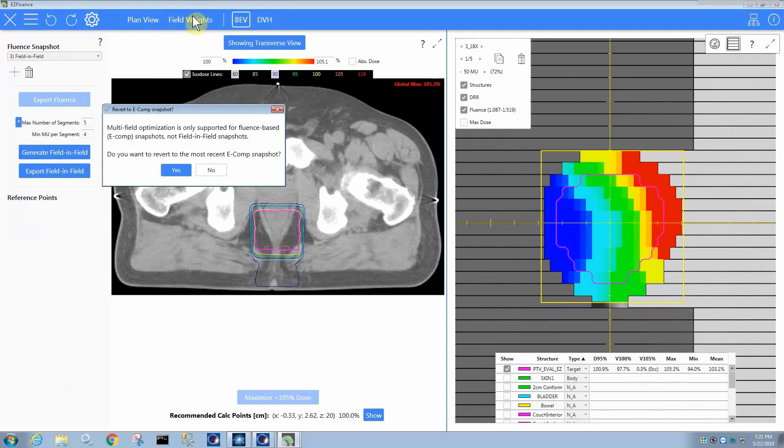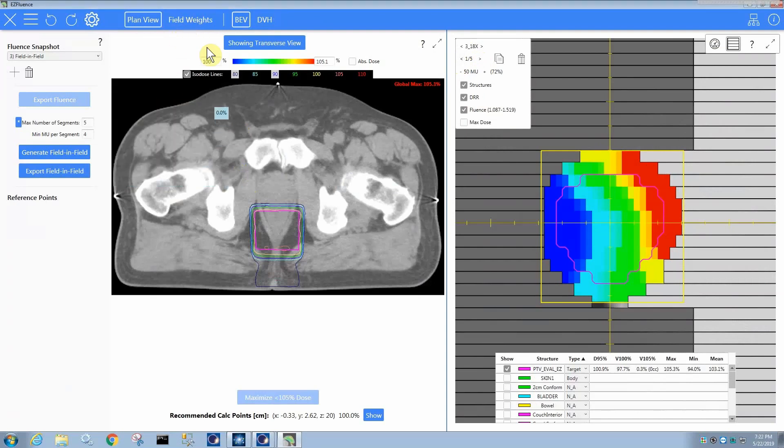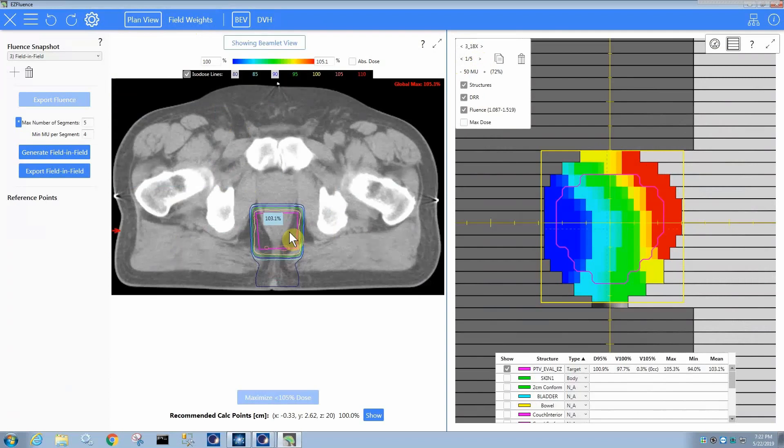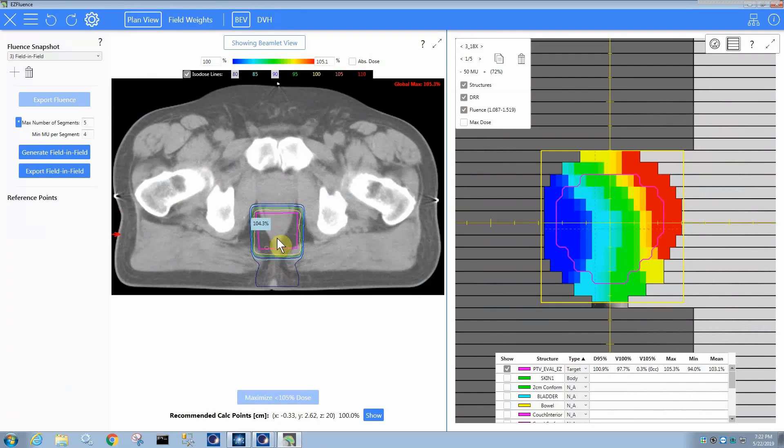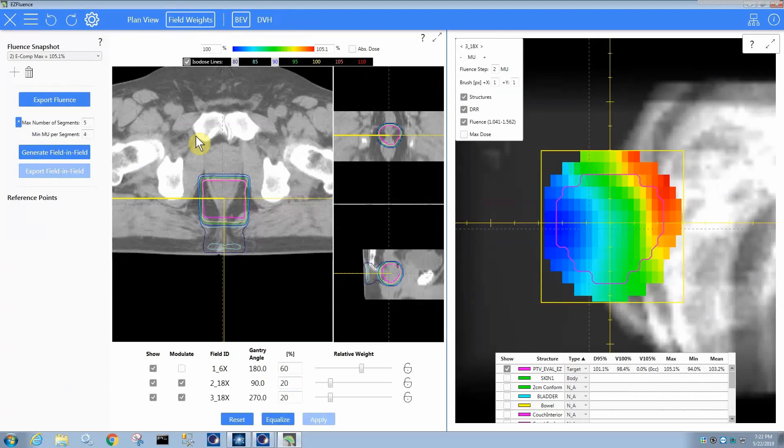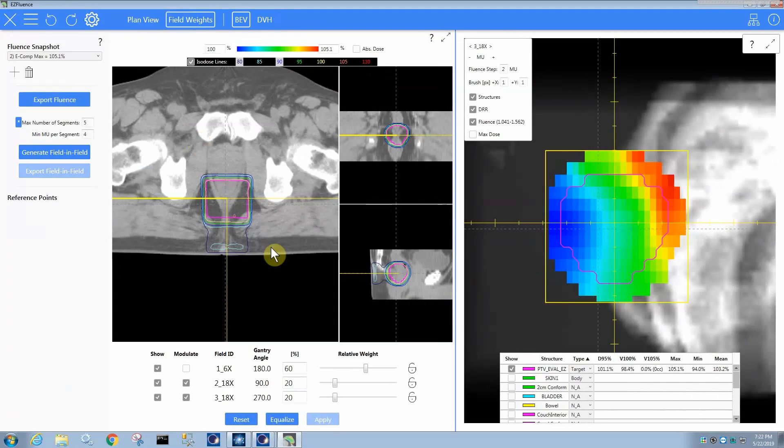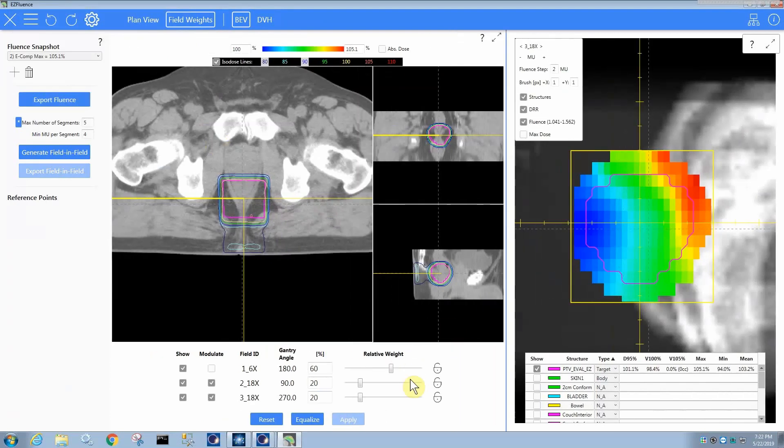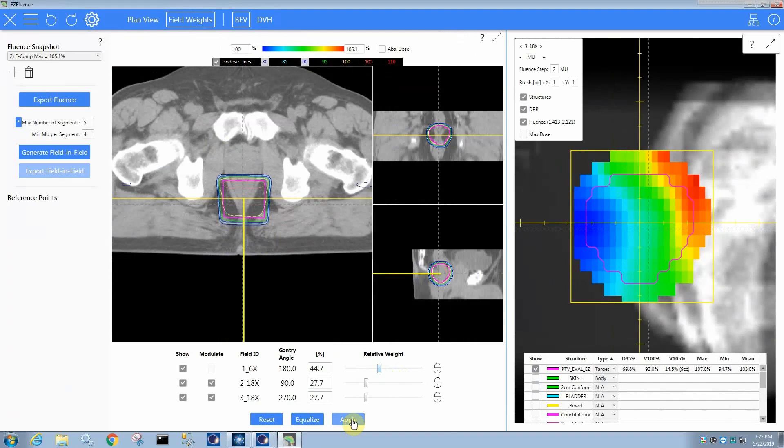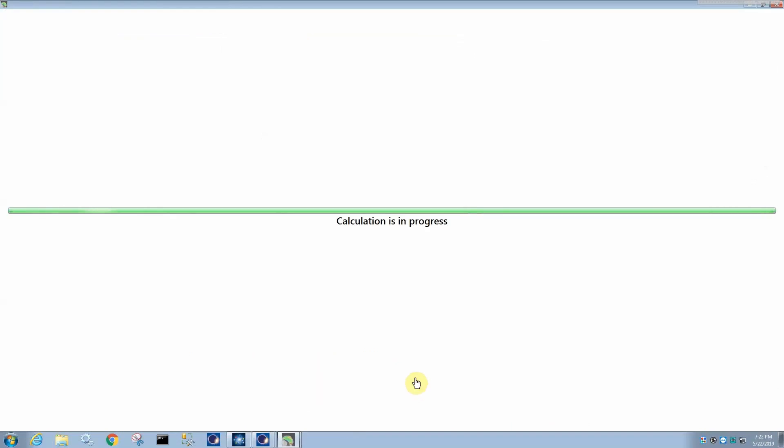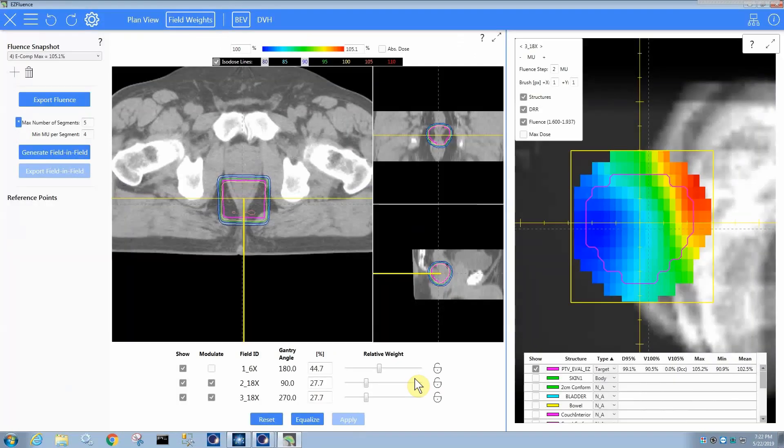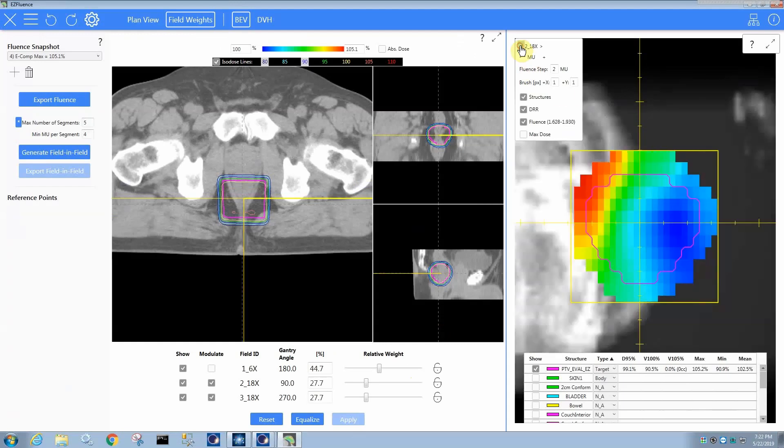If I did want to go back to the field weights tab. So the plan view tab, by the way, is the same view that you normally get in EasyFluence. If you want to see the video on editing, this is the place that you can actually just edit dose directly. But in any case, if you go to field weights, then you can, if you want, of course, adjust your relative field weights. Suppose we want less from the PA field, we can drag it. It gives you a preview of the dose, but you hit apply and it does the full fluence optimization. So now it has a little bit less of a wedge, it seems for this field.